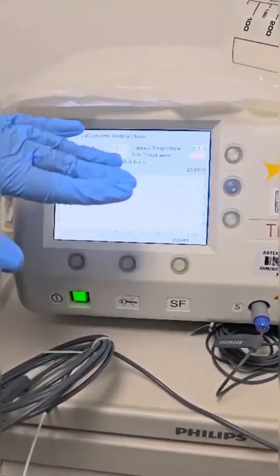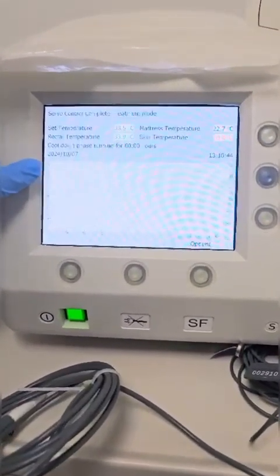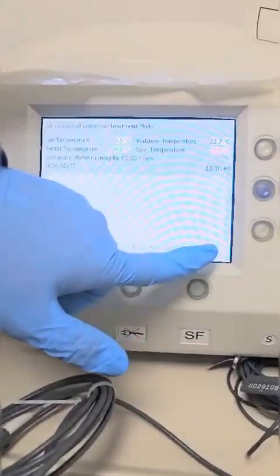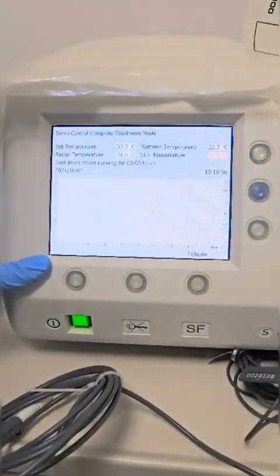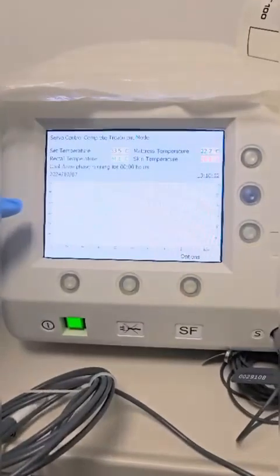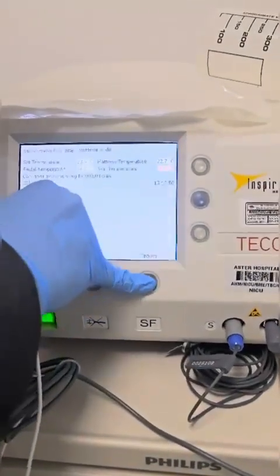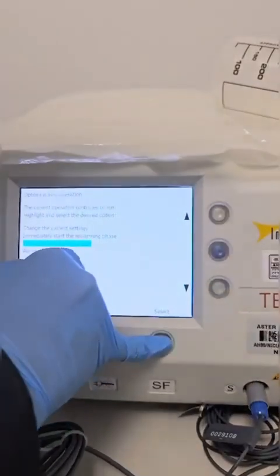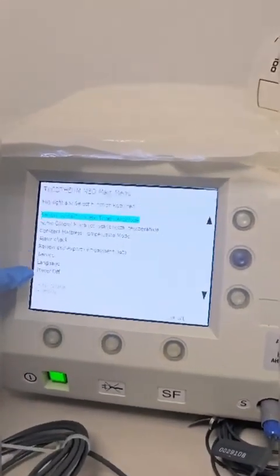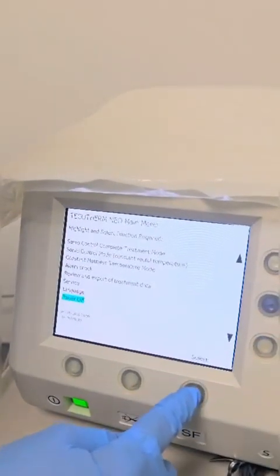In the treatment mode, you will see the temperature on the Y axis and the treatment hours on the X axis — a trend will be shown as time passes. Once you want to stop the treatment, you can go to option again, select end treatment and save data. Then you can switch off by going to power off. In this way you are operating the Tecotherm Neo.